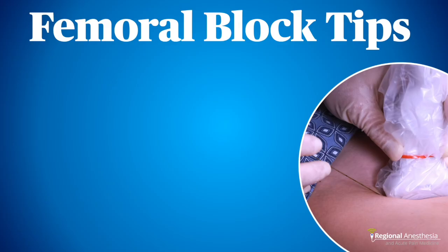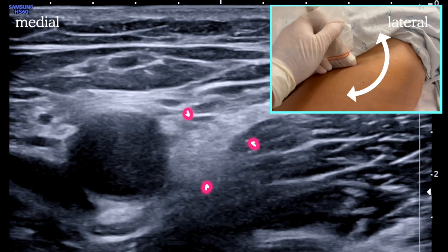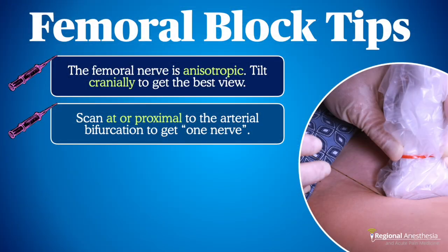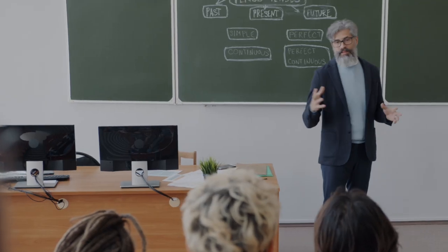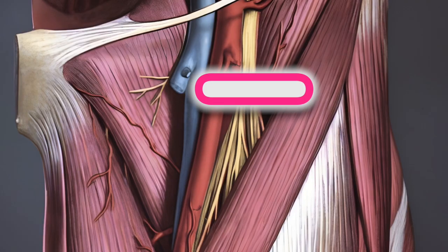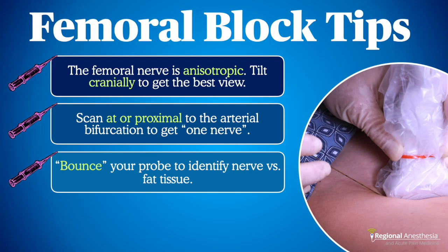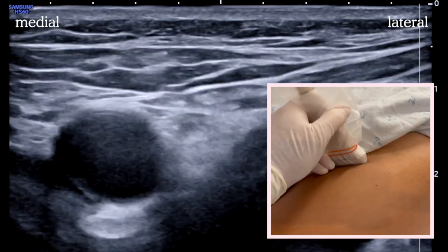Here are some tips and tricks for visualizing and blocking the femoral nerve. First, the femoral nerve is quite anisotropic, meaning that different angles of beam incidence will cause it to light up or disappear on the screen. A cranial tilt will typically result in the nerve popping out of the background. The femoral nerve arborizes — breaks up into tiny branches — at the level of the femoral artery bifurcation. If you're having trouble seeing it, slide the probe proximally to ensure you're at or above the bifurcation, where the nerve is one chunky structure. Another trick is to bounce the probe with some pressure, which compresses fat but not the nerve, helping draw your eye to the right structure.